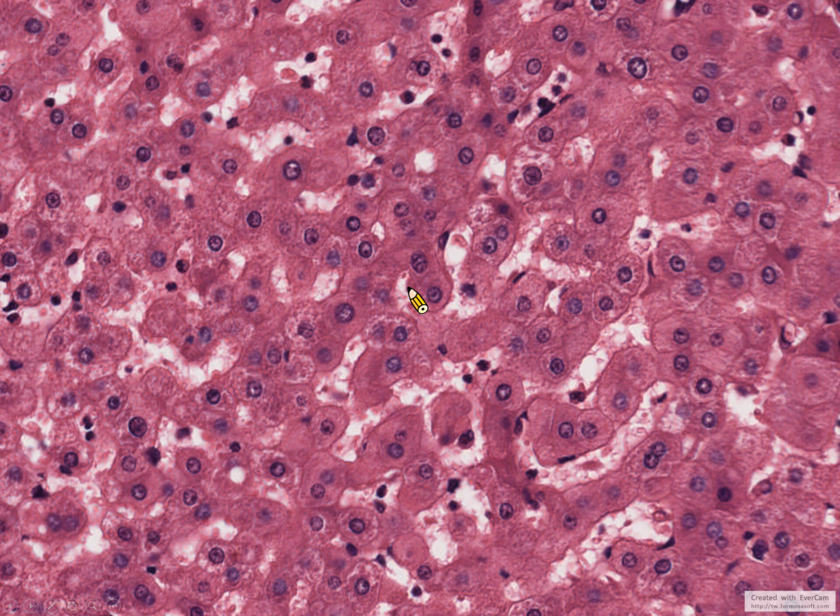Okay, so let me give you just a mini course on how pathologists can identify the tumor, the benign and cancer. This is one of the pathology images from the liver. Liver images contain hepatic cells, which produce bile.